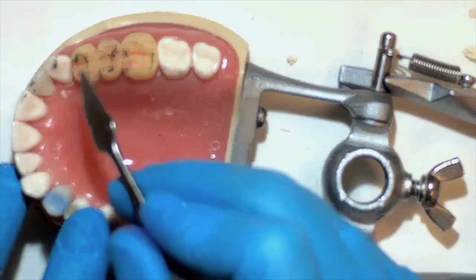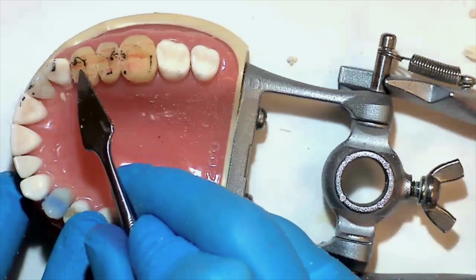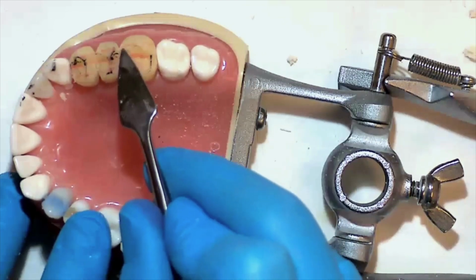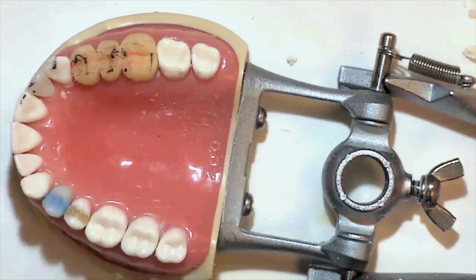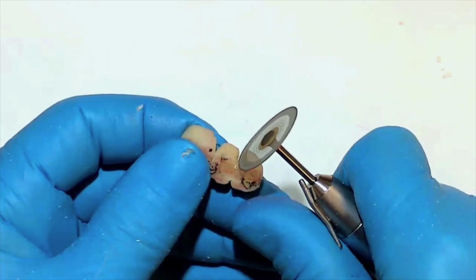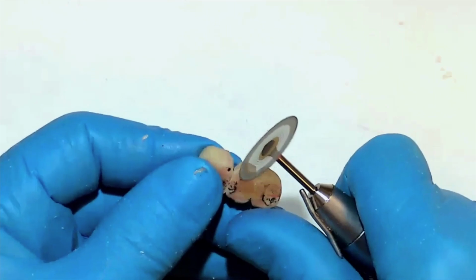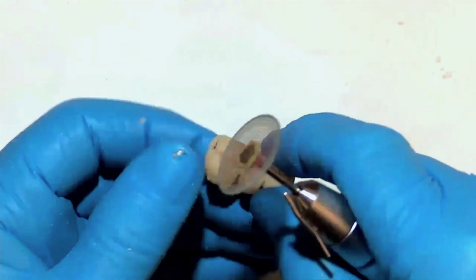Here you can see we've replaced it on an articulator, used some blue articulating paper, and gone into a working guidance, and you can see we picked up guidance on the premolars, both premolars, and just a little bit on the molar. It's not always possible on an articulator to get these very accurate because the articulator does not move in a smooth fashion.